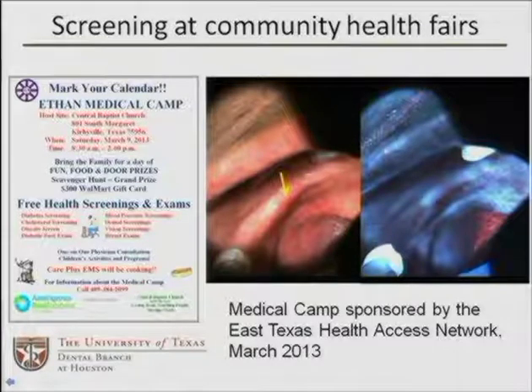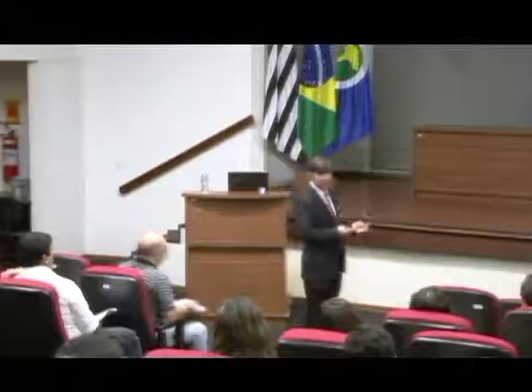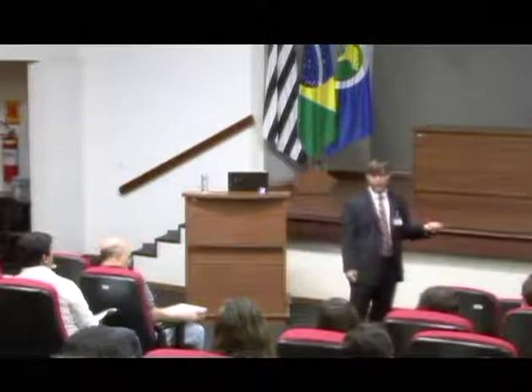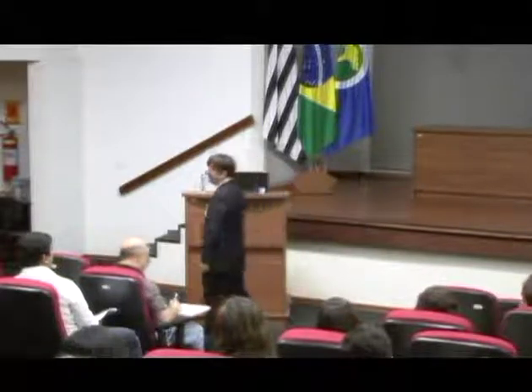But one thing that was very interesting was that we were able to take these images, and the clinician was then able to point to these images and show the patient what he was concerned about. That was the factor that actually convinced the patient to come in. So it was interesting to see that the imaging instrument had not only a role in the diagnosis, but also in the clinician-to-patient interaction. And I think it made the difference in getting this patient to actually contact the School of Dentistry and get scheduled to have a biopsy and to get evaluated.